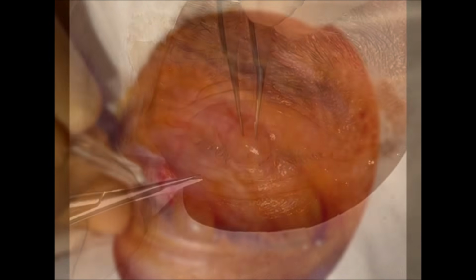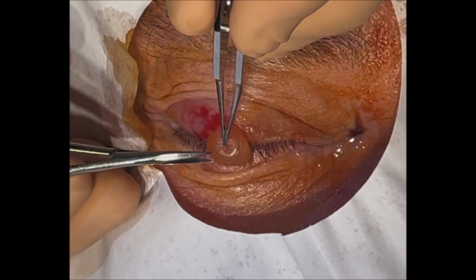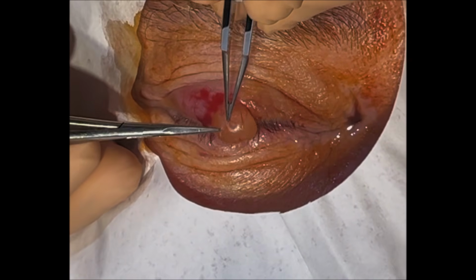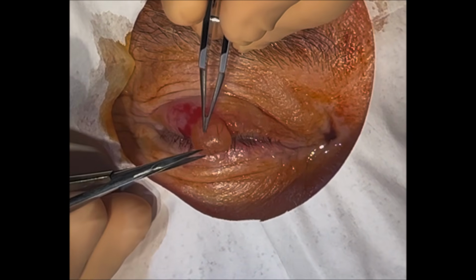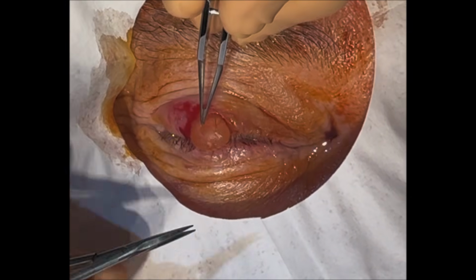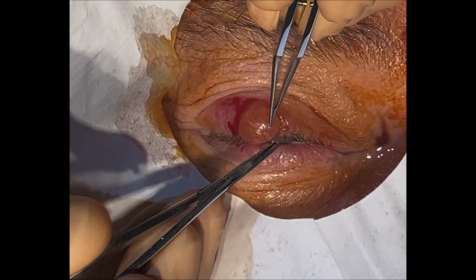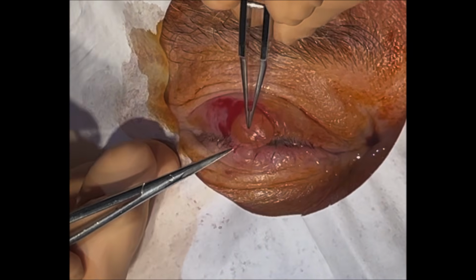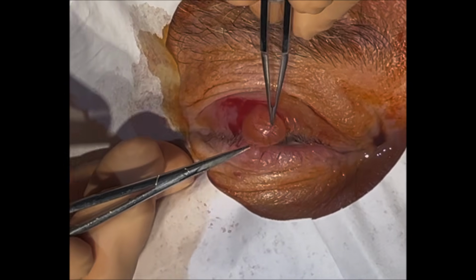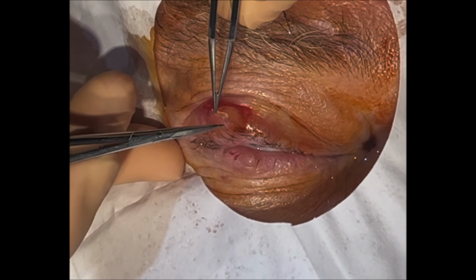So I just grasp the cyst, and these are some sharp Westcott scissors. And once I puncture through the skin of the cyst, you can see that there is a nice capsule. And I'm able to open it up. It's kind of like trying to open up a grape. You incise the skin of the grape. You try to go around it without puncturing it. You can see I'm able to just peel away the skin.